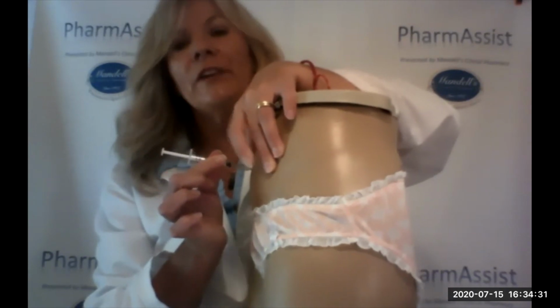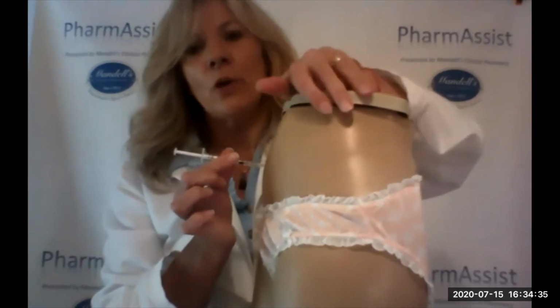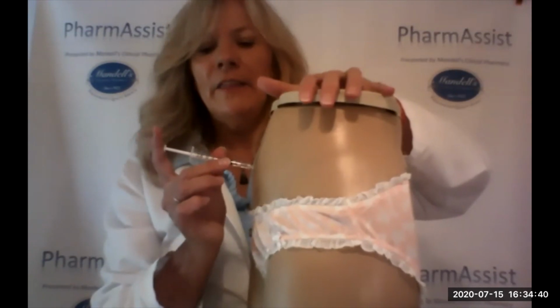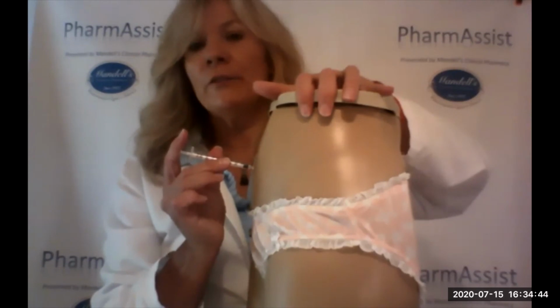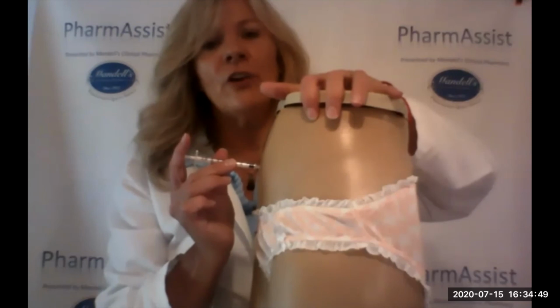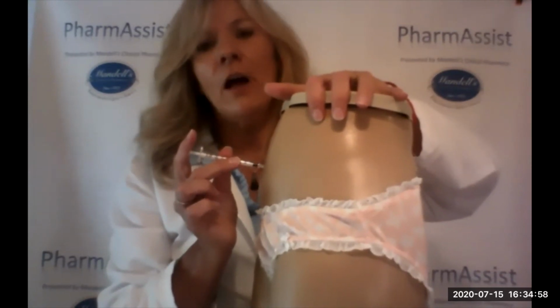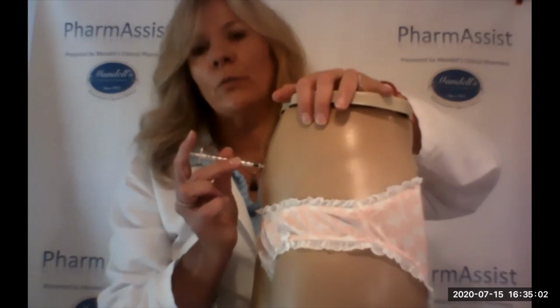There's where you will feel your mosquito bite. That's exactly what it feels like when those little needles go in, a little quick mosquito bite. Now you don't even feel it. Then we press that fluid in there, and with multi-dose, you probably will not even feel that medicine go in. Most patients that I speak to after I've taught them their shots, they'll say, wow, I was really surprised at how little you said I would feel, and I actually really didn't feel anything, and I thought I would feel a lot more. And that makes me happy, so that it reassures them and reinforces what we're teaching.